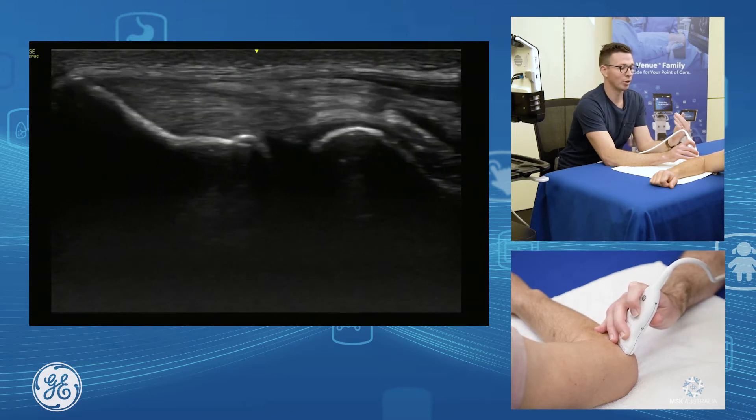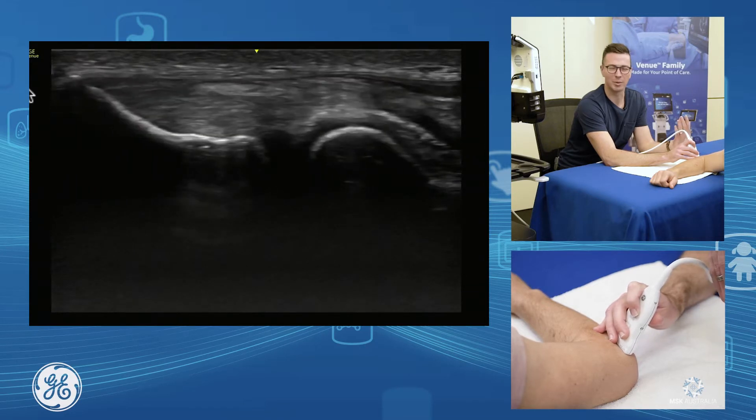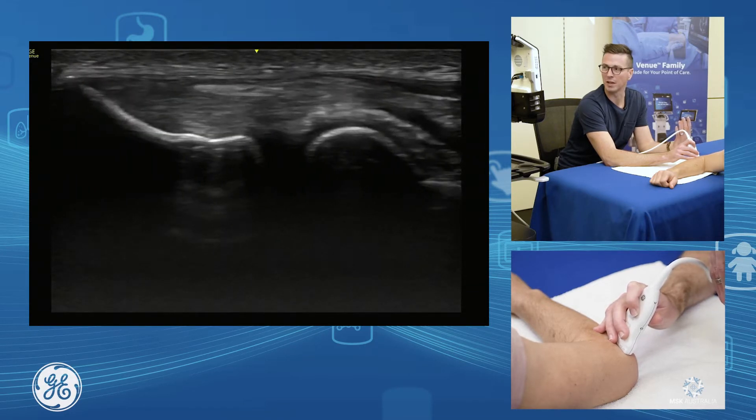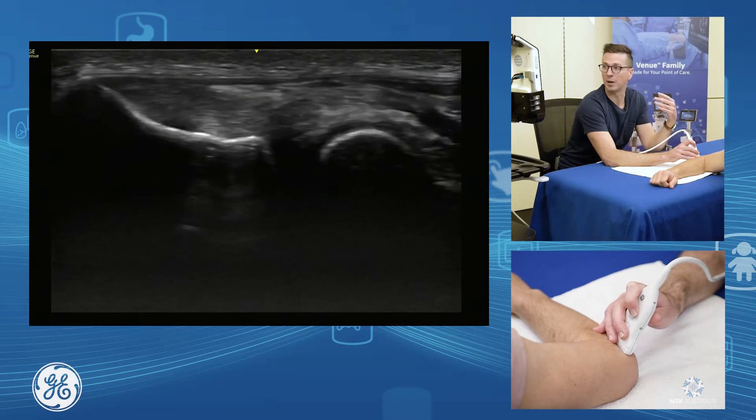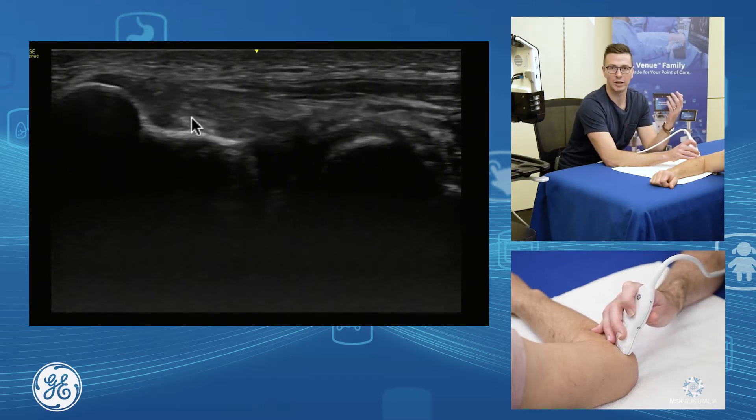If I bring my probe to sit straight in the middle of the common extensor, I get most of the bulk. As I bring my probe up towards the patient's head and drift up through here, I get more up into the extensor carpi radialis brevis component — the main component of your common extensor.